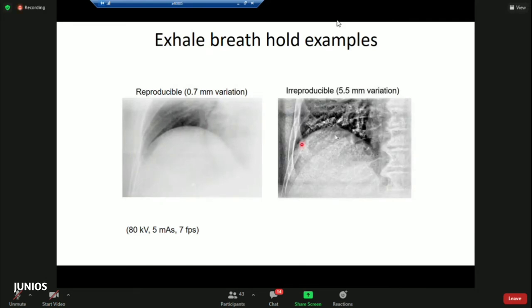And some patients, you know, we think that our surrogate, the RPM device or any other surrogate, is within the gating threshold, but internally the anatomy, the liver, is actually moving. So in that case, RPM is not a good surrogate as a measure of liver reproducibility. So not all patients work perfectly. Typically the obese or large patient, just on the surface, thinks it's the same position, but internally there's more chance of moving.